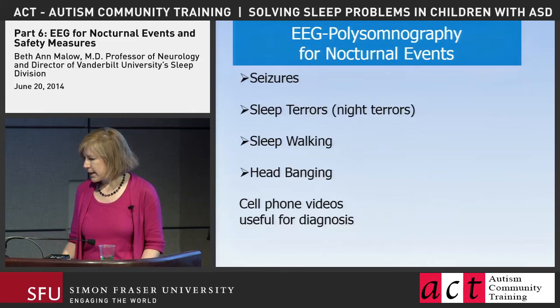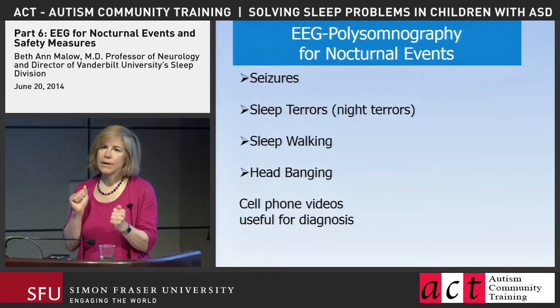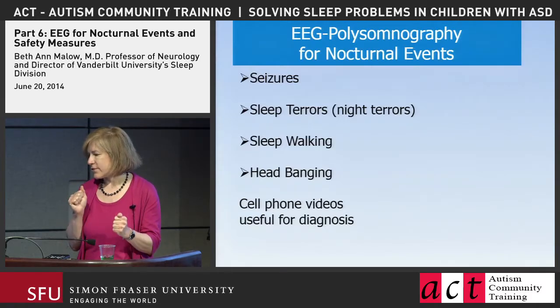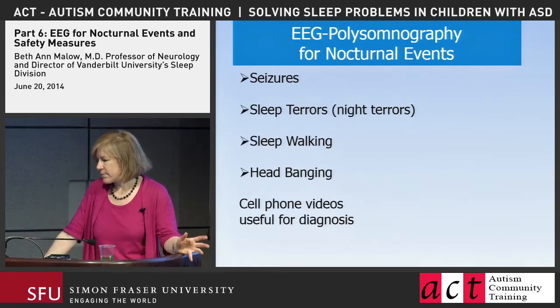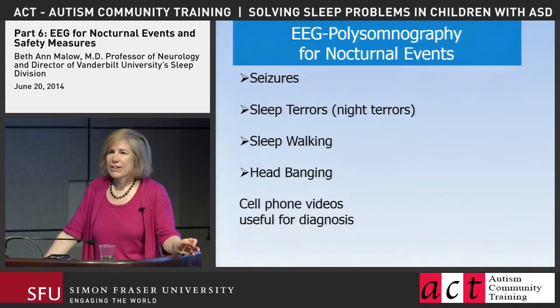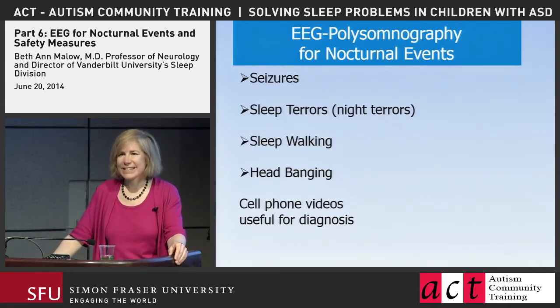In terms of some of these other uses of the EEG, sometimes we'll combine the sleep study with an EEG. We call it EEG polysomnography to try to detect seizures, sleep terrors, also called night terrors, sleepwalking, head banging. And I want to make a pitch here. When we try to bring families and kids into the lab and we want something to happen, it won't, even if it's happening every night.